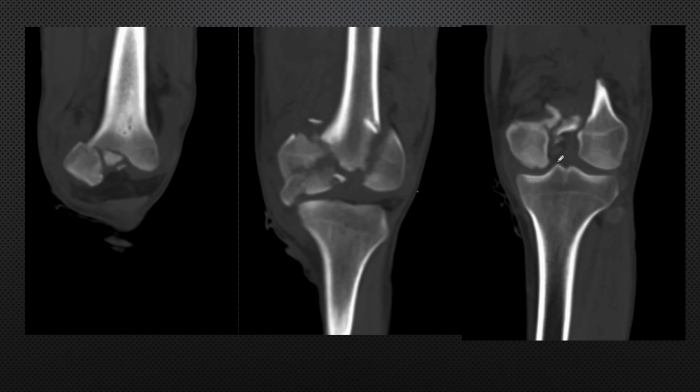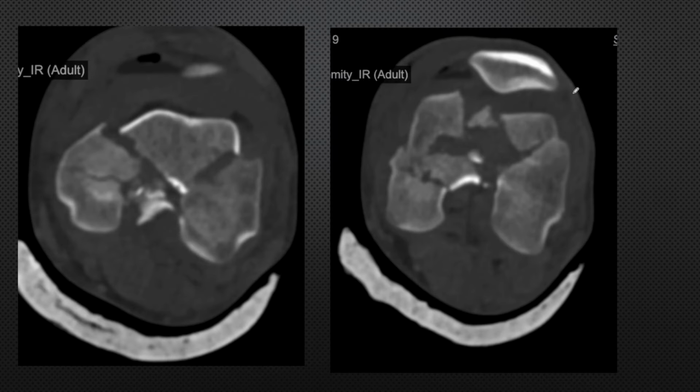And as we go more posteriorly, we are able to see the posterior condyles. The posterior condyles appear to be somewhat intact. That means they are not comminuted. And on the lateral side, it is very clear it is not comminuted, but again there is comminution in the notch part. Now we go towards the axial cuts.